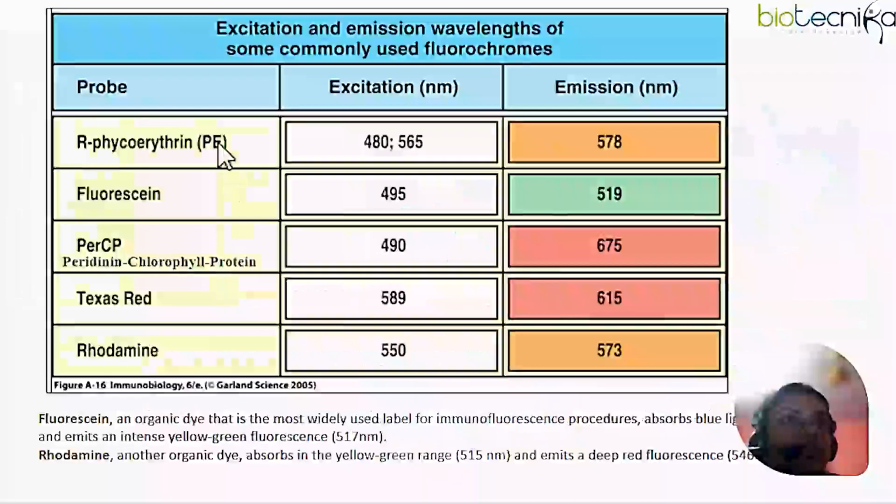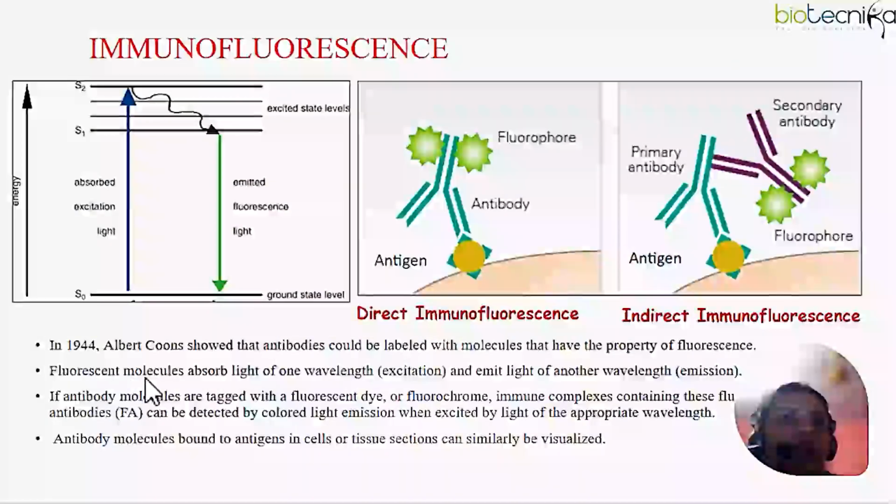So in this, while they are coming down to the ground state, they will release all that energy, what we call the emitted fluorescence light. This gets detected by your microscope, and this is the basic principle of how it works.